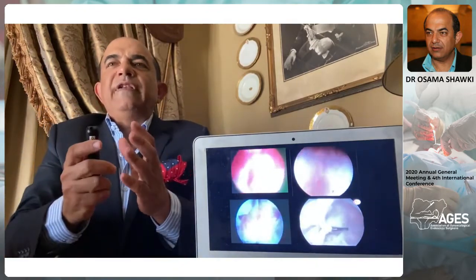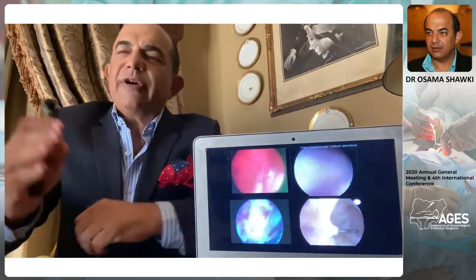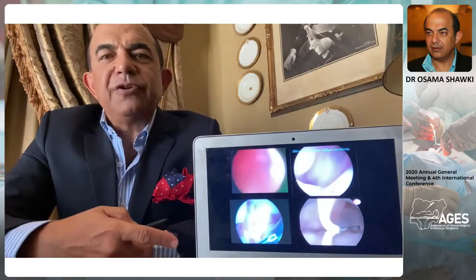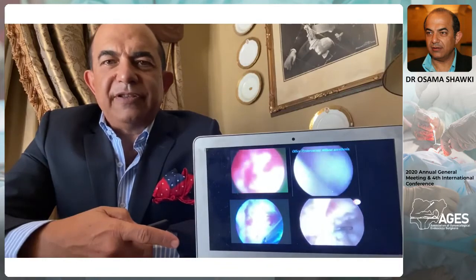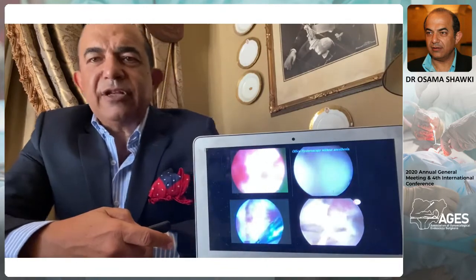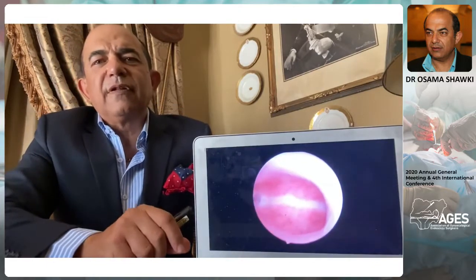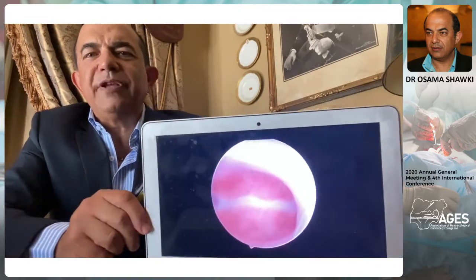Especially you don't see a panoramic view, you cannot see where is left, where is right, and it's difficult to perform a procedure with this visibility. It should not be like this. It should be different. It should be like that. That's the way it should be.